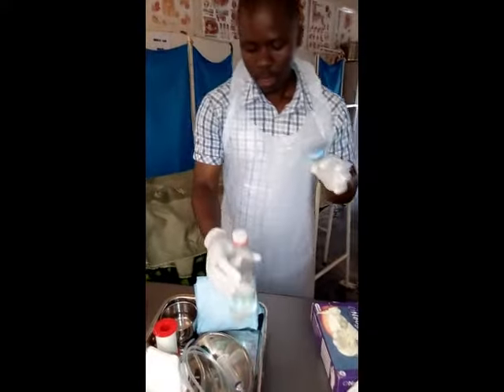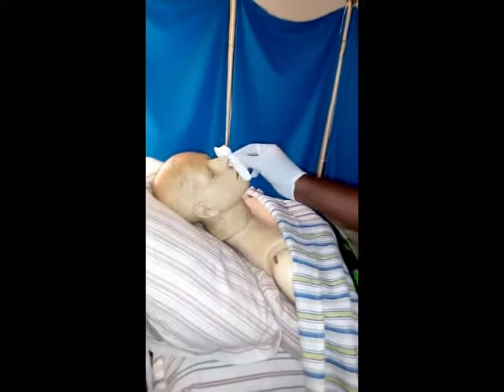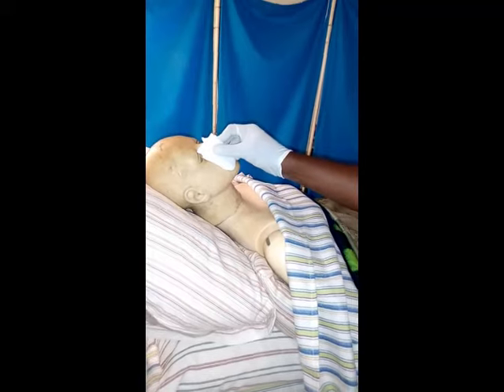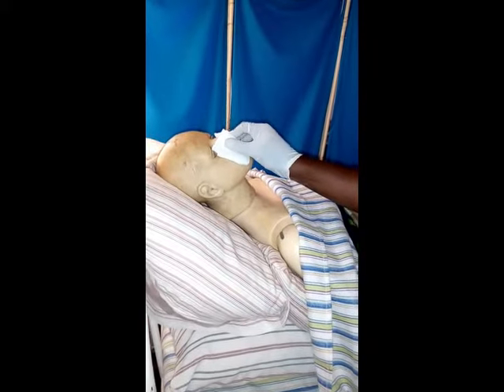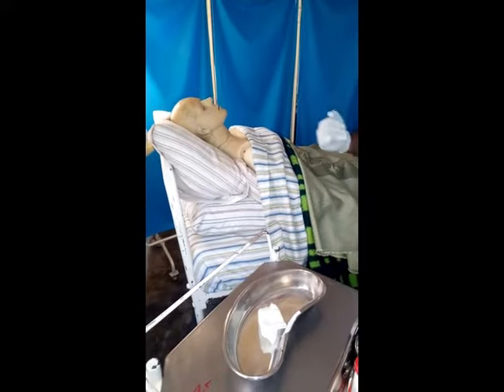Okay. Then you go to Mrs. Mwape. So you get gauze. You go to Mrs. Mwape, then you ask Mrs. Mwape to blow. So Mrs. Mwape, blow your nose. Okay. So Mrs. Mwape is blowing her nose. Okay. After having done that, then you need also to continue to test for patency. She has just blown her nose. So now let's see which nostril is more patent than the other.